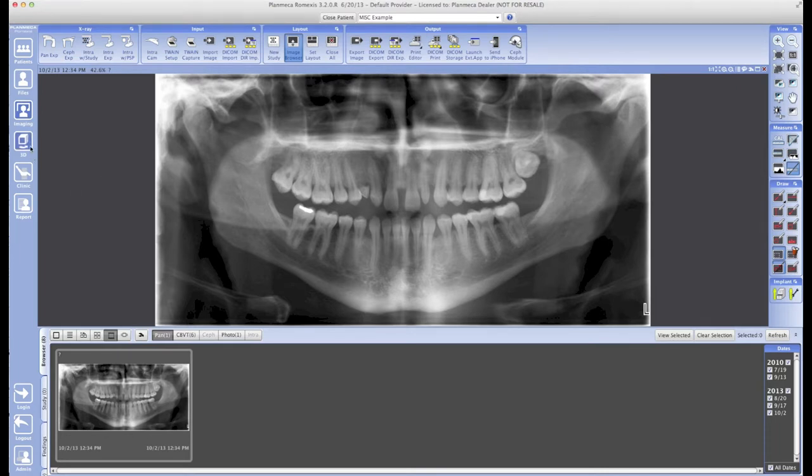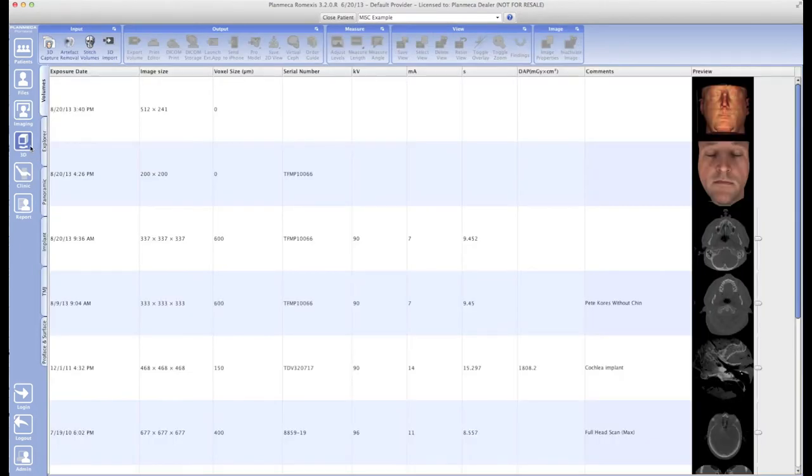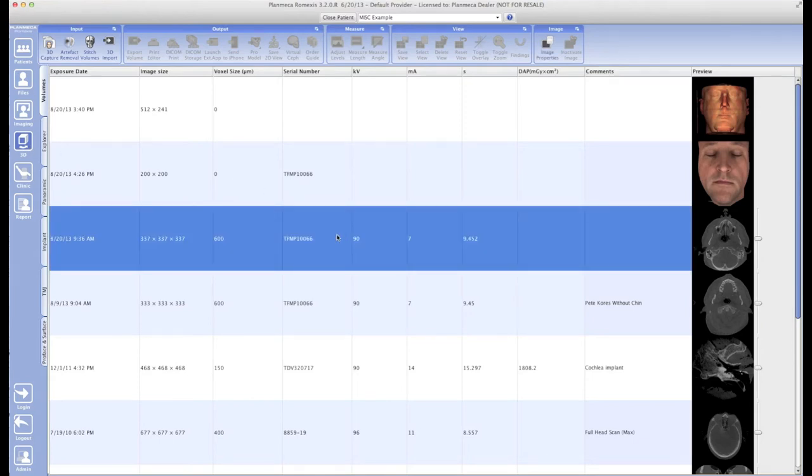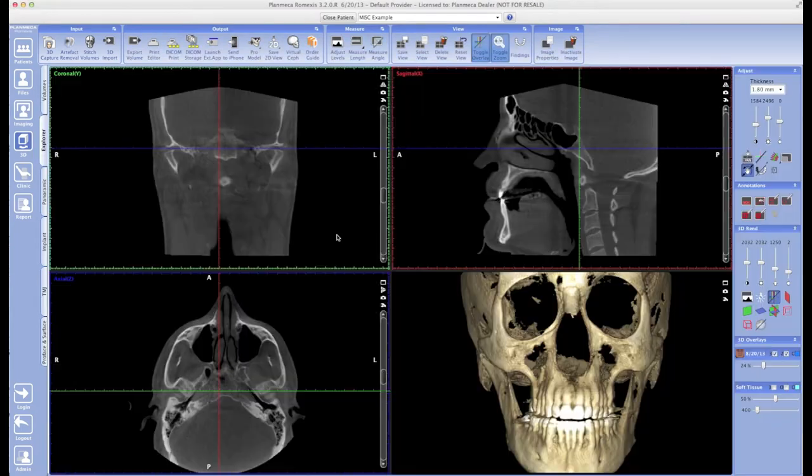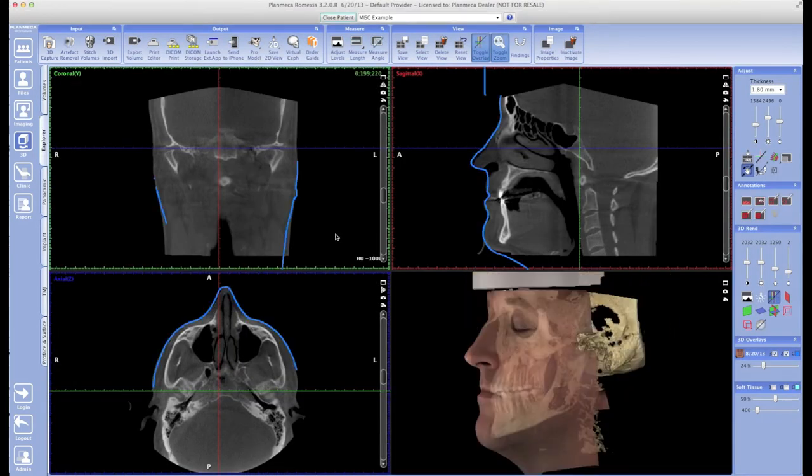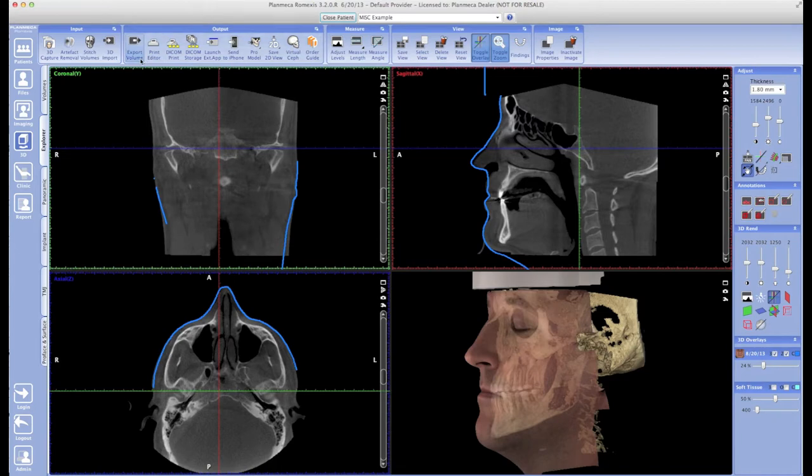I'm going to double-click to open up a 3D volume that I want to export. Once that 3D volume is open, I'm going to go up top under my Output tab and click on Export Volumes. That's going to give us a similar-looking options window.